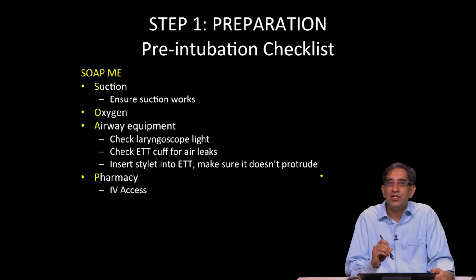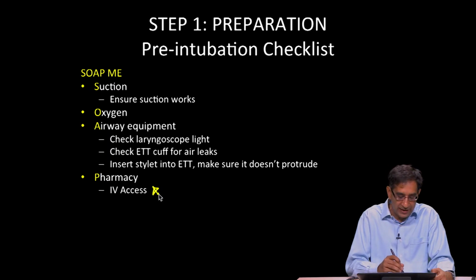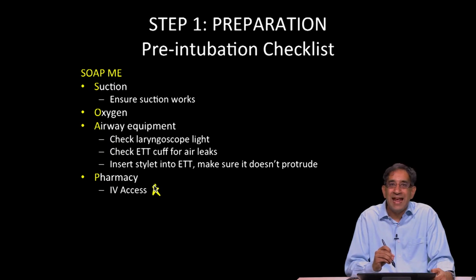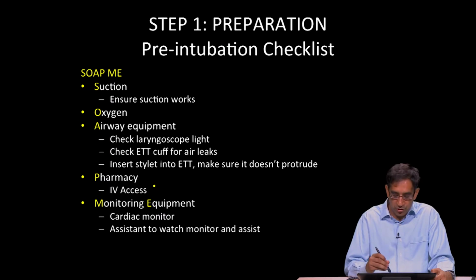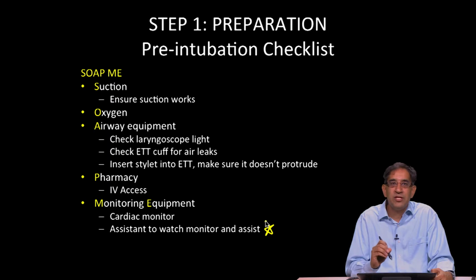Again, insert that stylet into the endotracheal tube, but make sure it doesn't protrude so you don't injure the patient. If you're going to give medications, if you're going to do rapid sequence intubation, make sure you have your drugs available and that you have IV access. I would say in general, in any emergent patient, obtaining IV access is going to be beneficial. And then think about your monitoring equipment, your cardiac monitor and your pulse oximeter. Have them available, and then make sure you assign someone to watch these things, because when you're performing the procedure, you may lose sight of the monitors. So you want to have somebody who's paying attention to the monitors.